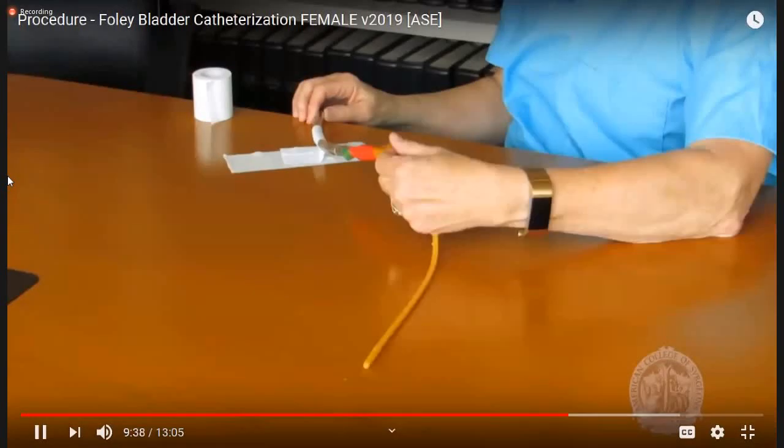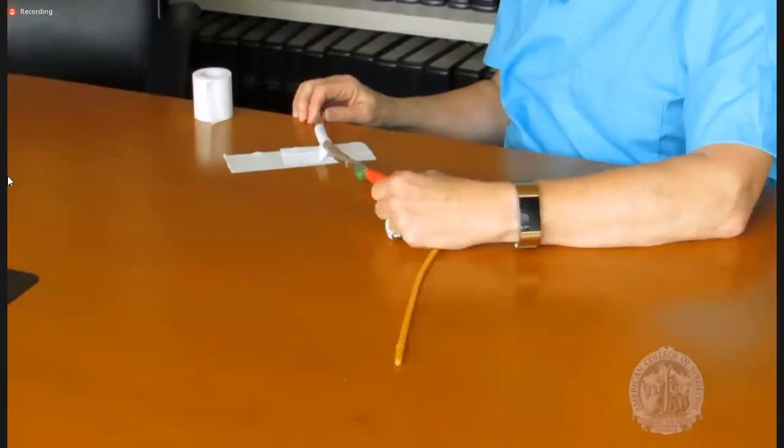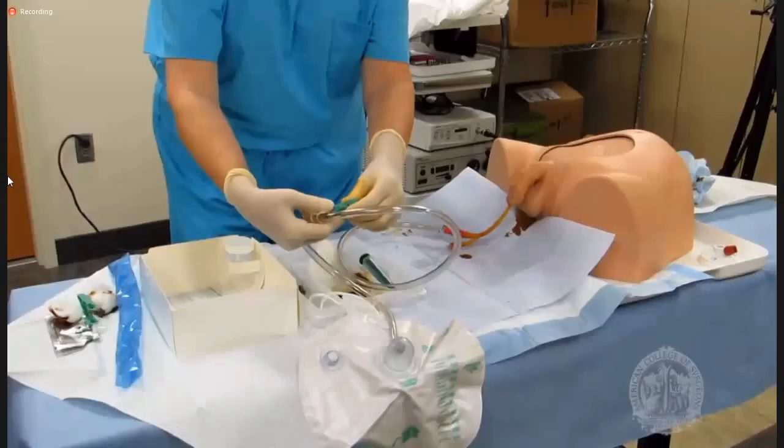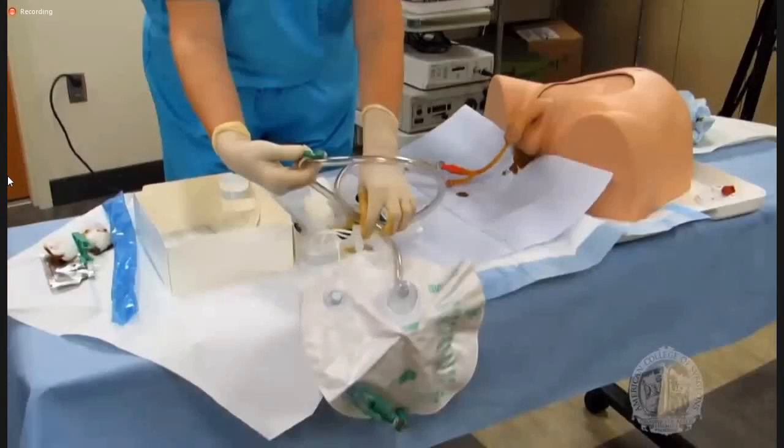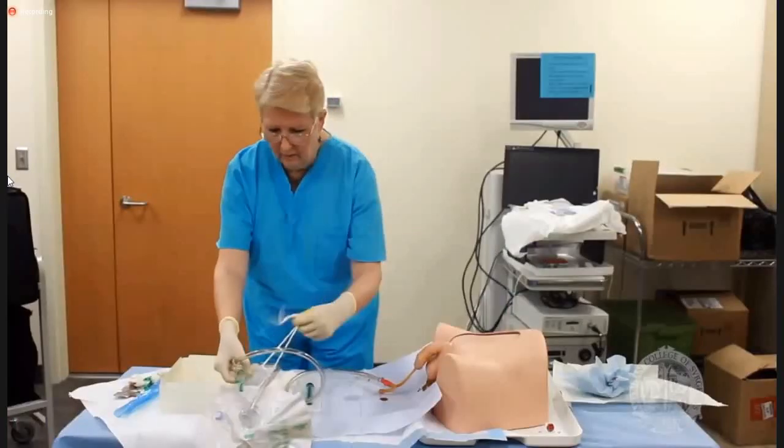Whether using tape or a commercial stabilization device, leave enough slack in the catheter and tubing so there's no tension on the bladder neck. The tubing can then be clipped to the sheets or the patient's gown. The bag should be placed in a dependent position and maybe hung by the string or the hanger above the bag. Let's talk about errors and complications.